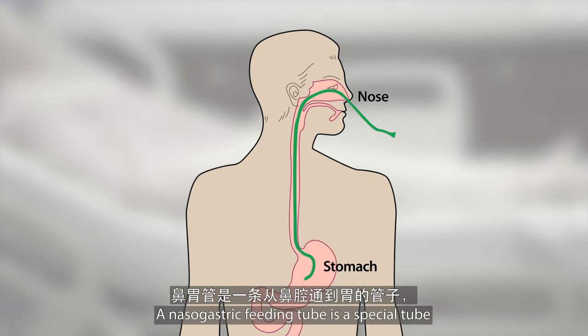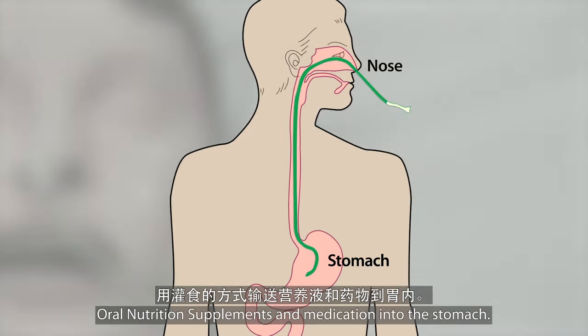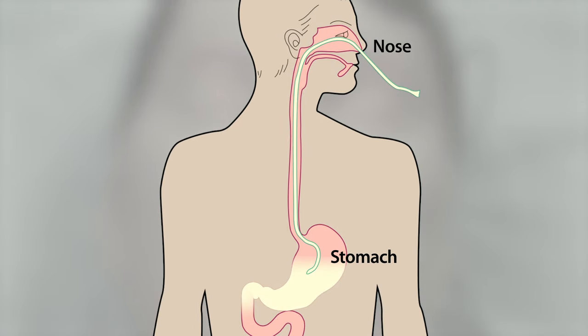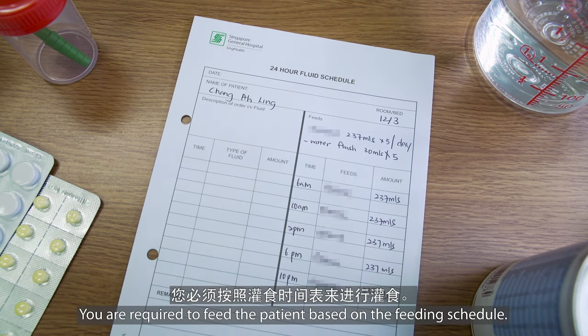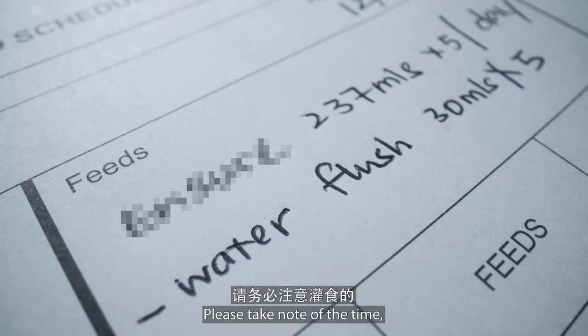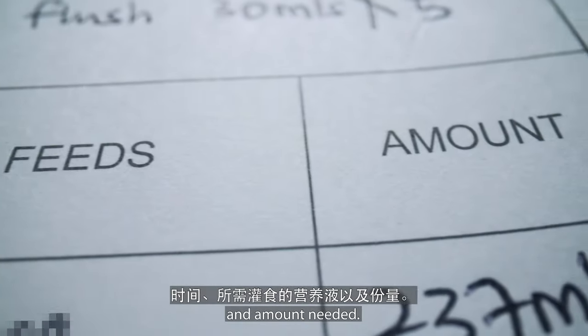A nasogastric feeding tube is a special tube inserted through the nose for delivering oral nutrition supplements and medication into the stomach. You are required to feed the patient based on the feeding schedule. Please take note of the time, type of oral nutrition supplement, and amount needed.